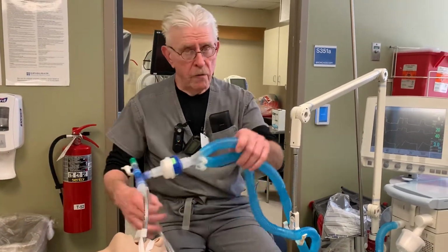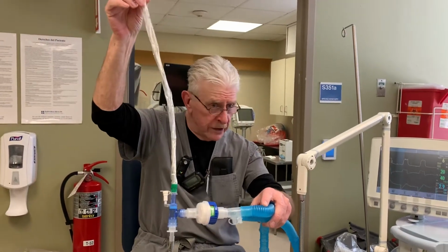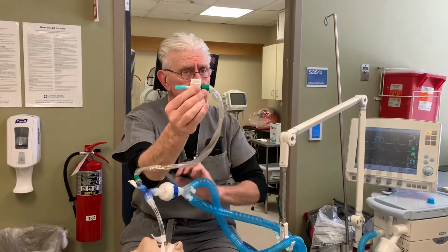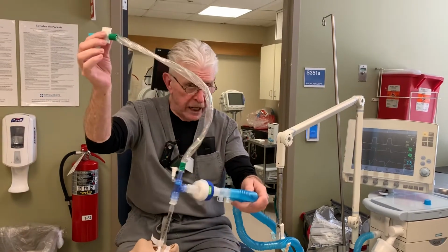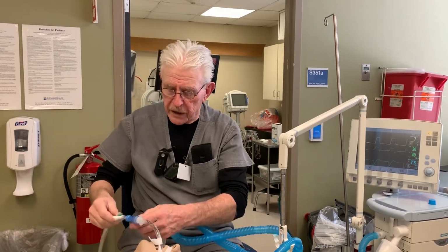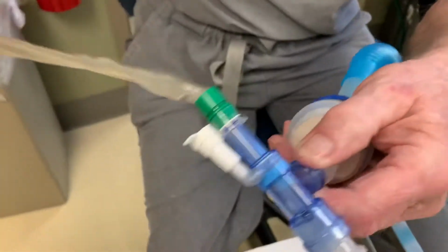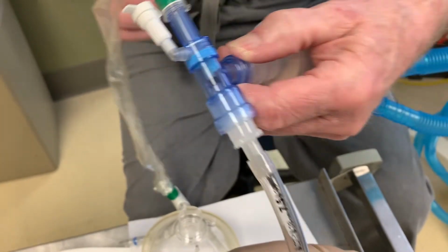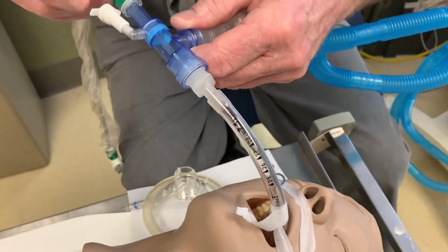All right, so for these endotracheal tubes, you will also see there's a Ballard suction in line. There is an on-off switch for the Ballard suction, and when you lift it and rotate it, it shuts it off so it can't be inadvertently used. When it's not in use, you will see a little black line on it; this is the proper position for it when it's not in use. You don't want to leave it down in the tube, into the patient, because it represents an obstruction to their ventilation.